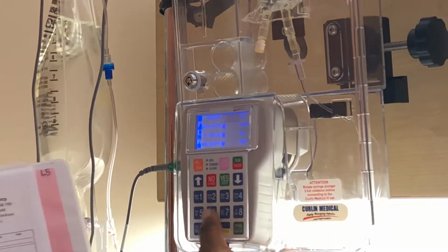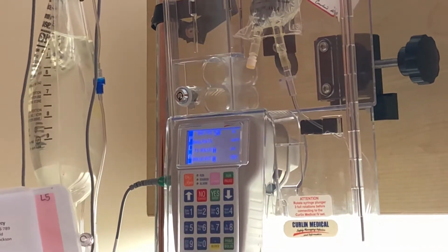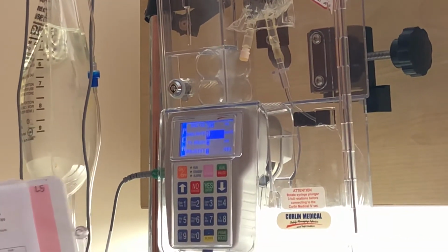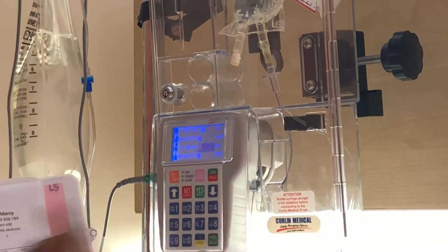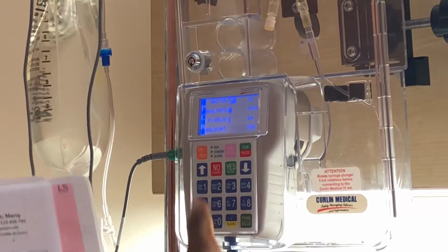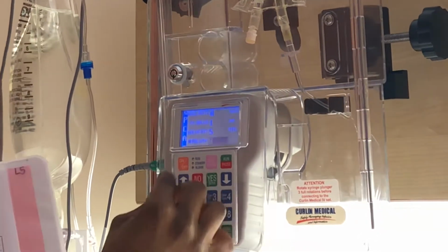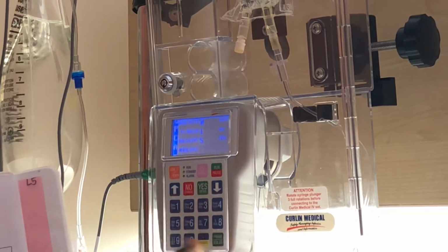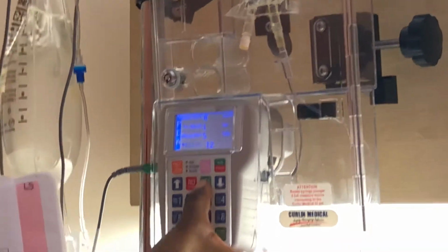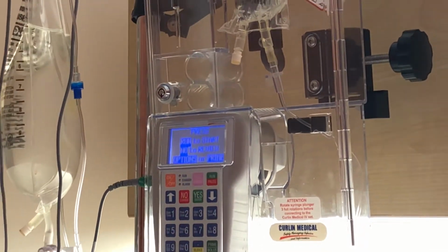Bag volume, total bag volume is 50 mils, so yes. Basal rate is, there is no basal rate, so 0, yes. And patient bolus is 1 milligram, so 1 milligram, yes. And the time, 5 minutes. So 5 minutes, yes. And the bolus per hour, so 60 divided by 5 gets 12. Yes. So done, yes. And then I'm going to press no to review.